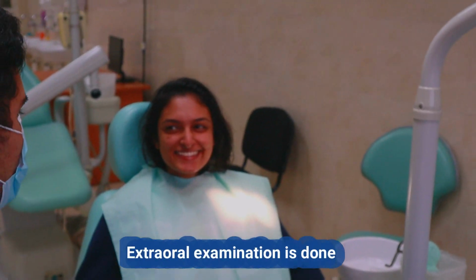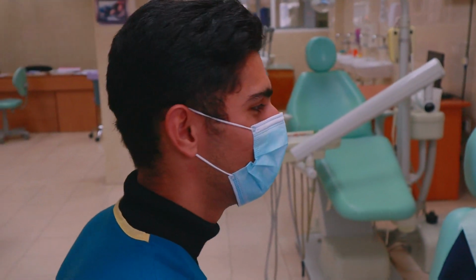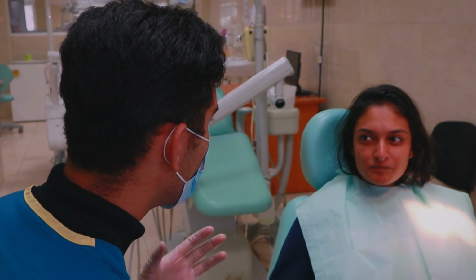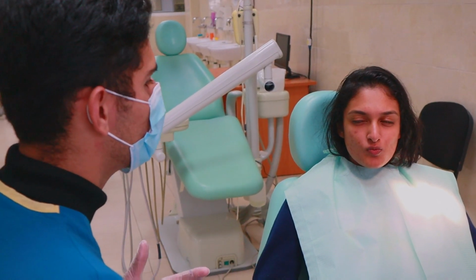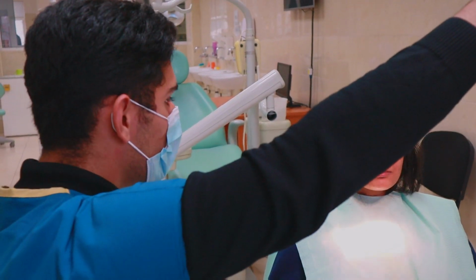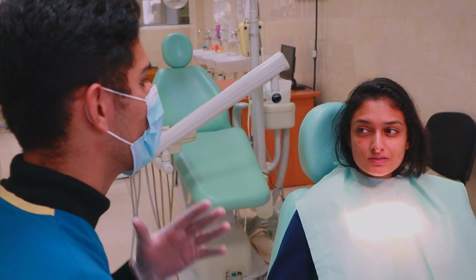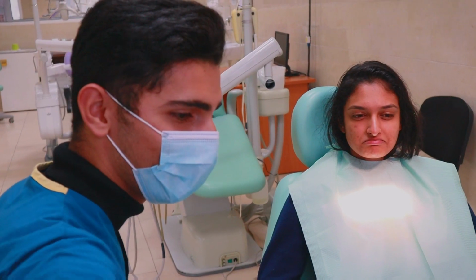So the extraoral examination is done. The next thing we're going to be doing is the intraoral examination of the teeth and soft tissues. Any sort of cuts or lesions there, or any sort of problems that we need to check up on. And then after that, we're going to be checking your teeth. Every single tooth, I'm going to go in an order, and we're going to check every single one to see if there's any problems.